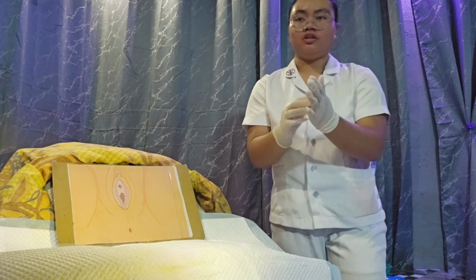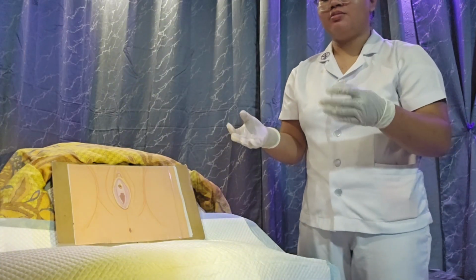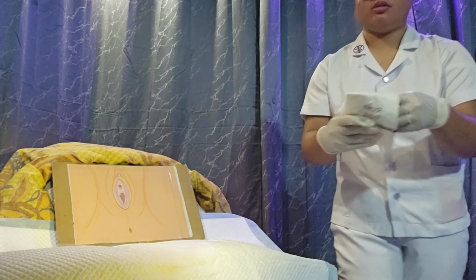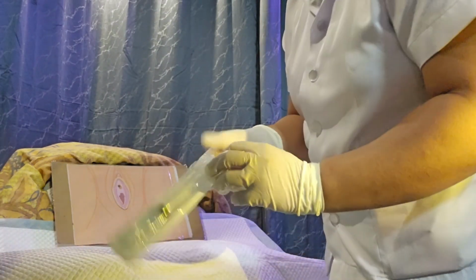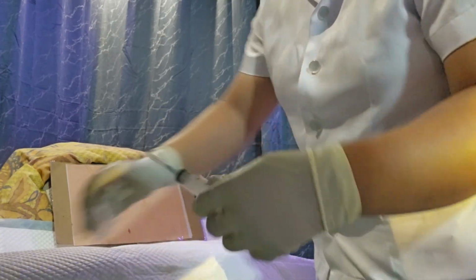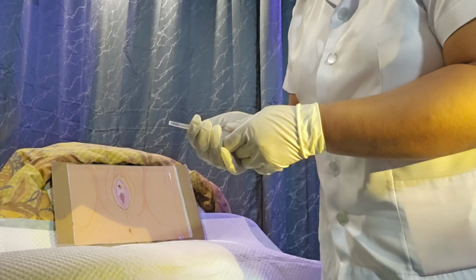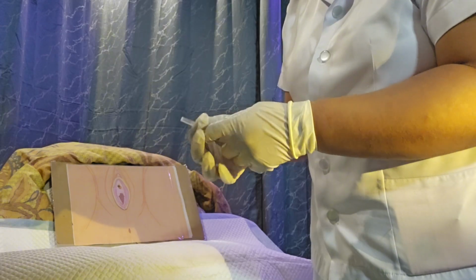So after putting on the gloves and ensuring that it fits perfectly, you're now going to prepare the syringe for inflating the balloon of the catheter. So we are going to use a 10 cc.